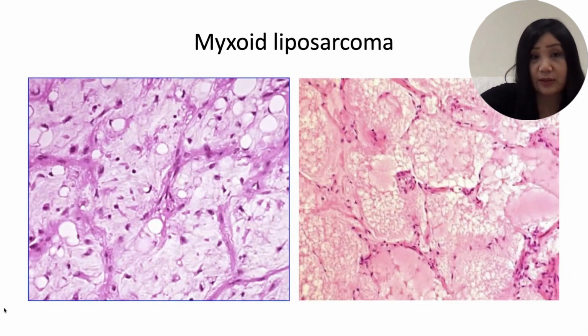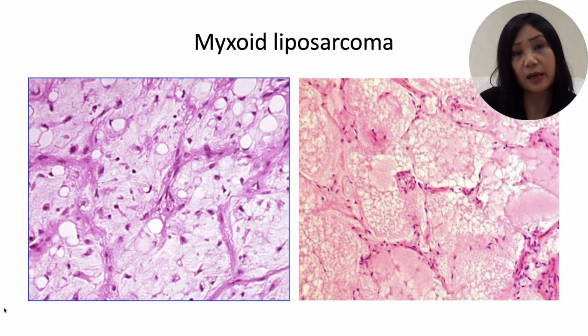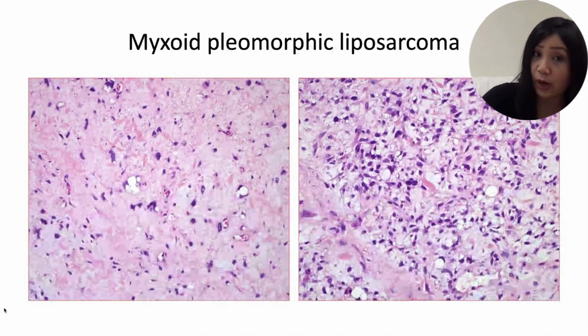No real new updates on myxoid liposarcoma, just for us to remember this very characteristic morphology of bland ovoid cells with a prominent, evenly spaced curvilinear vascular network, associated with DDIT3 rearrangements with FUS or, more rarely, EWSR1.